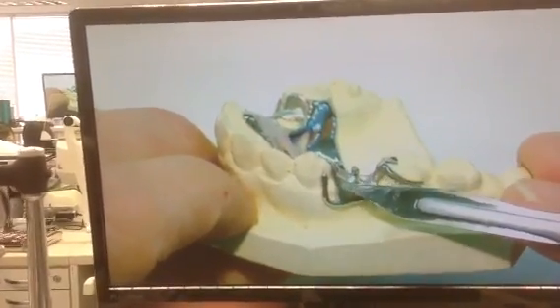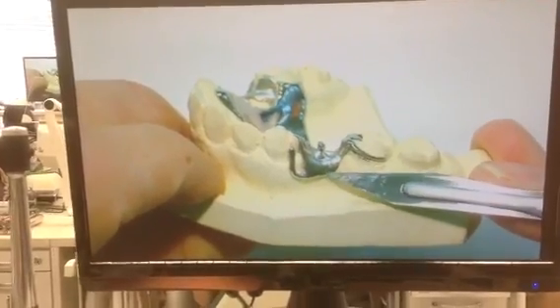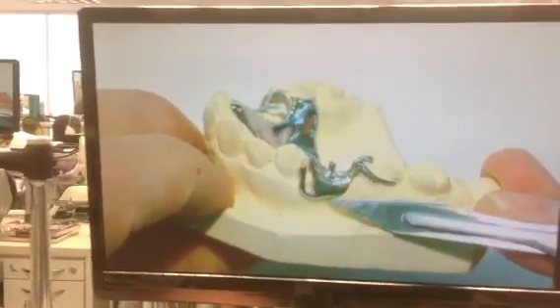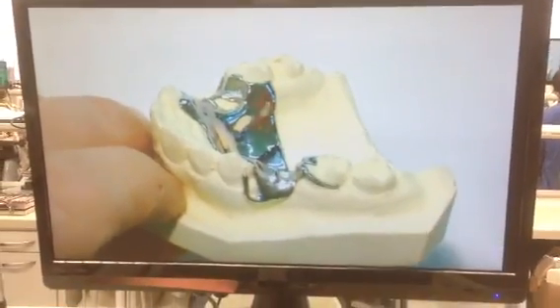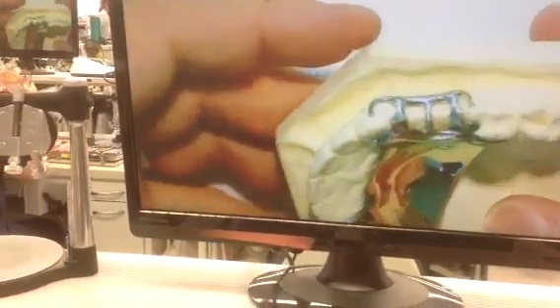And this would have been drawn where the acrylic probably was drawn down below the metal in the drawing, because this metal has been thinned all the way down to prepare it to be covered with acrylic. So again, you can put it with the metal outside, the acrylic outside the metal, or put the line on the same spot.